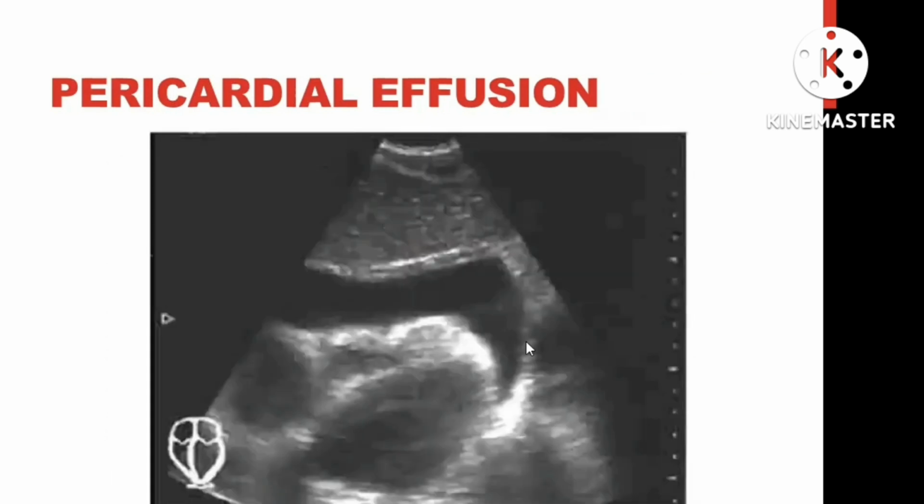Here, which view? Apical. Yeah, so far. Sometimes wrong. Subxiphoid, right? So right, left. Which one is left? Right atrium, right ventricle, and this one. And look here, it looks like the RA is dilated.